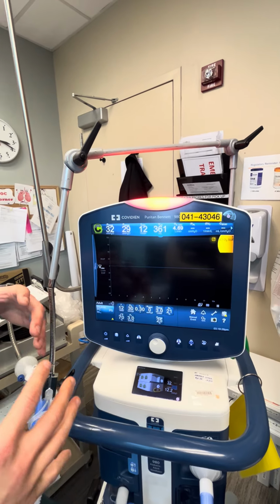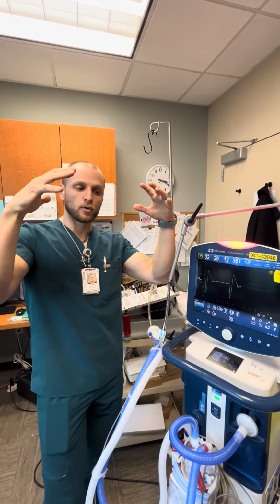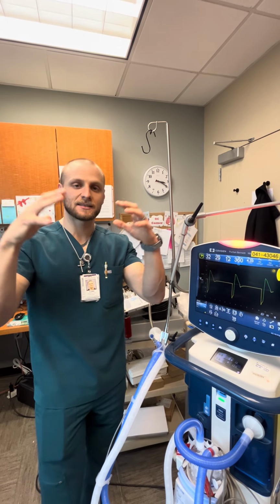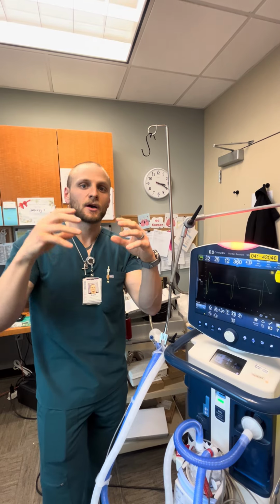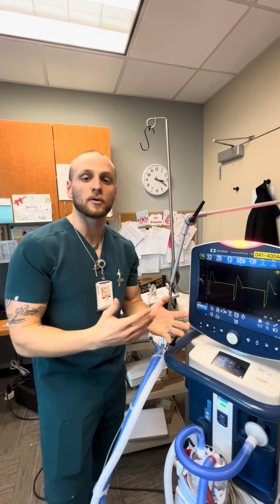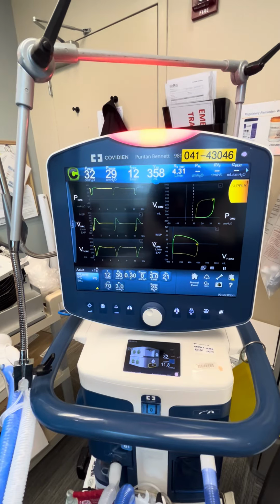So within the patient, we're keeping them at the pressure that is appropriate for their lung tissue to recruit alveoli to oxygenate, right? We're dropping them 12 times a minute to aid in ventilation, but we're only dropping them for 0.3 seconds at a time to where we're not letting their lungs over collapse, causing peripheral collapse and all those things. So we're keeping the lungs happy throughout the whole time. Okay, so right now this is exactly where you would keep your patient in this therapeutic kind of mode until the patient either improves or goes backwards, right?